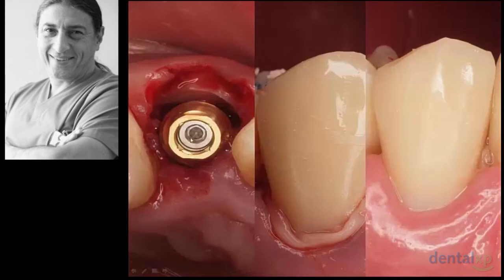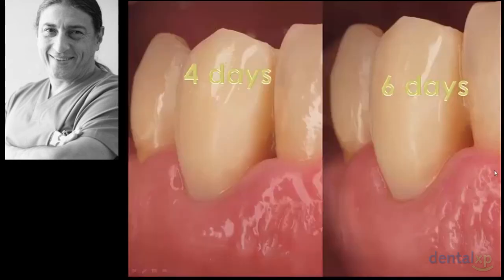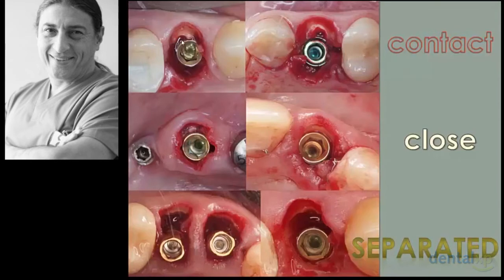You can see here the implant and the shield. This is the provisional that we put with a PRF. You can see after 4 days the tissues, and after 6 days the quality of the cicatrization. Let's say that it is almost an ideal case to have this kind of cicatrization. The implant-shield relationship may be in contact, close, or completely separated. We've done different cases and we found no difference in maintaining the buccal aspect of the alveolar process.